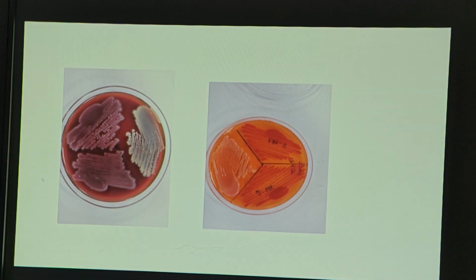But this is the blood culture they have sent from this patient. You can see Serratia from the blood culture, on blood agar and MacConkey agar, both samples from this patient, we got Serratia marcescens. So this Serratia, what is the source? Maybe probably the urine, because the urine culture they didn't send to our laboratory, though the urine pus cells, everything is favoring. Cellulitis is there, but it is rare that Serratia may cause cellulitis. It may cause sometimes, but it is rare. So the patient got discharged.